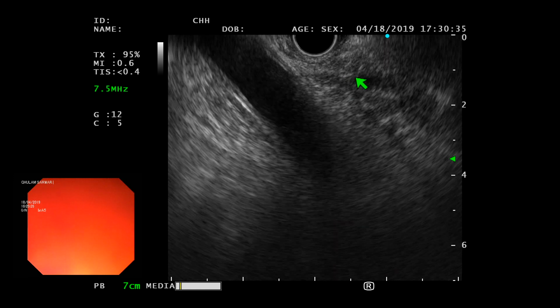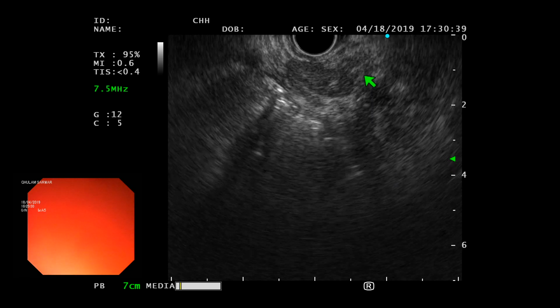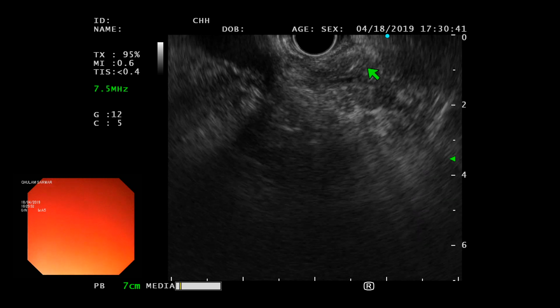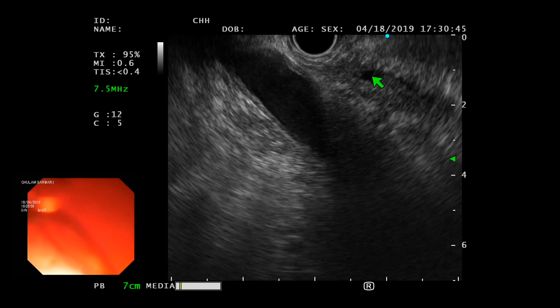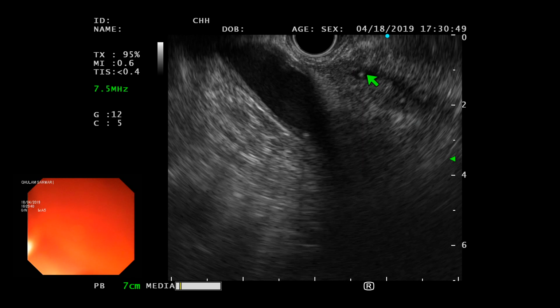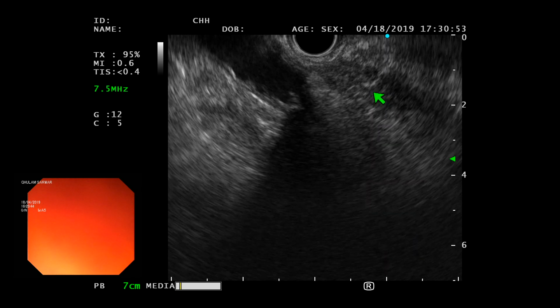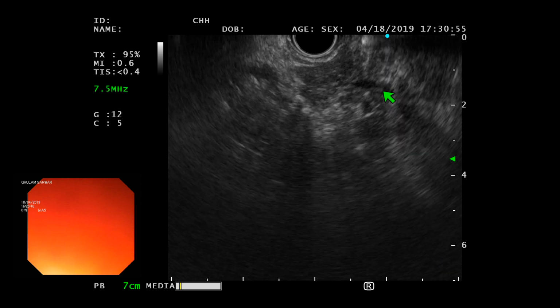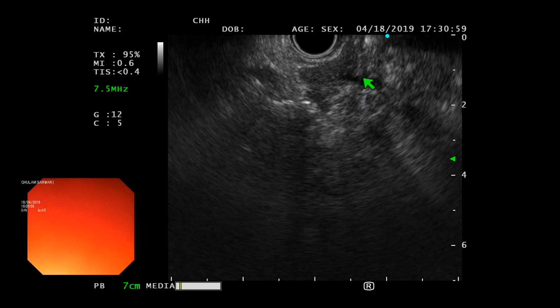From there, do you see some pancreatic structures here? You see the pancreas right here, right? You see the pancreatic duct, and this is the bile duct right here. Aorta, bile duct. I said after aorta, the bile duct is going to come. This is the uncinate process. From there, I rotate it further to the right, and then you see the pancreatic duct right there.